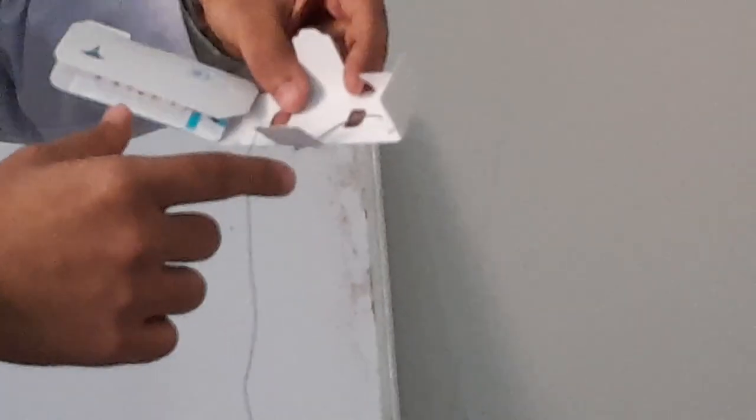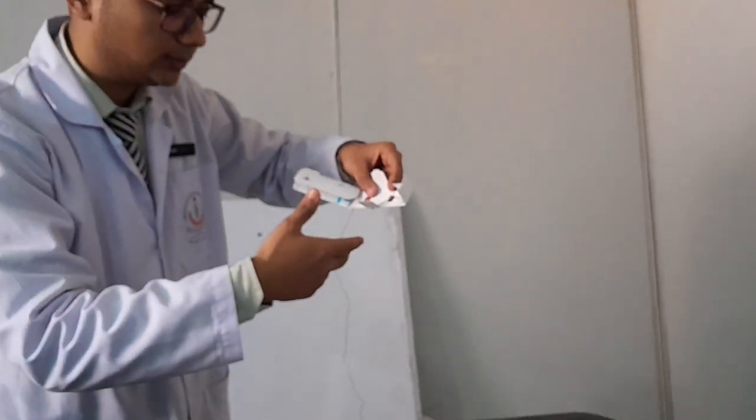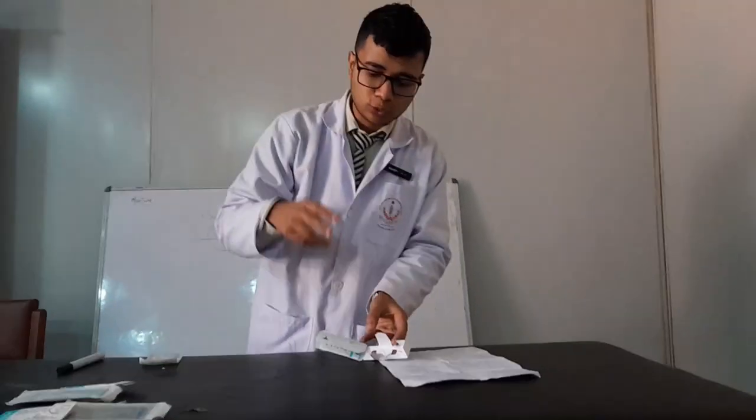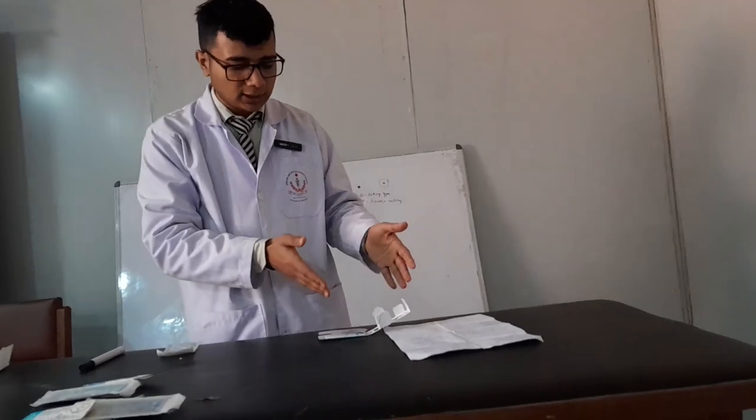So one advantage of multifilament suture is that it is easier to make a knot. If we use monofilament type of sutures, then we have to make multiple knots. However, in this case 2 to 3 knots will be sufficient.